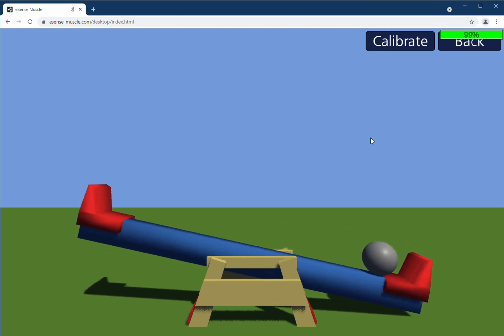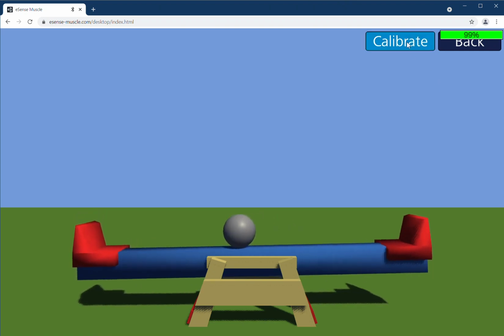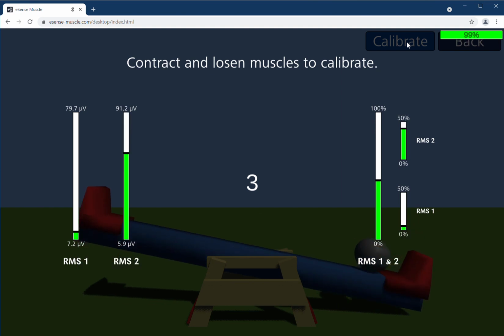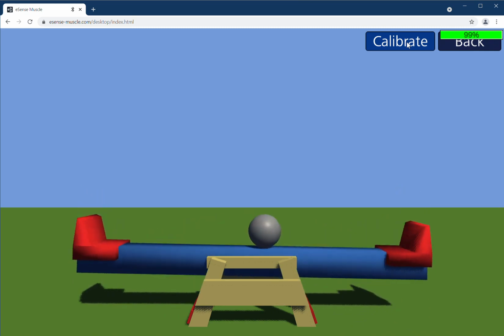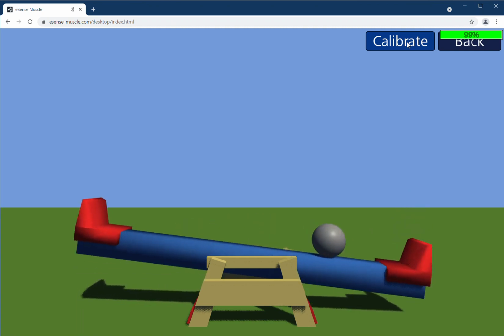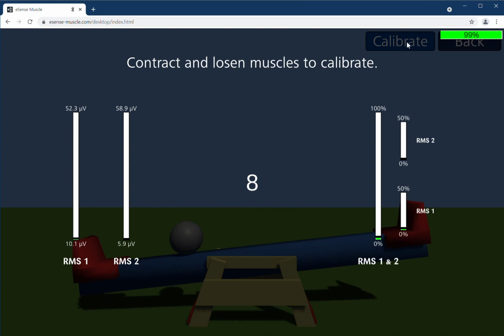You can always recalibrate whenever you like. When you say, okay, now I want to recalibrate again, then you just click on calibrate. You can do this in every game and every animation, and if you initially did not calibrate that well, then you can change that. Usually people tend to contract their muscles really strong during calibration, and then later on when they need to contract and loosen very often, they get tired, and it's better to recalibrate and make it easier again.